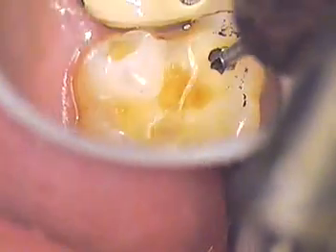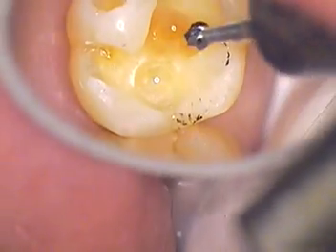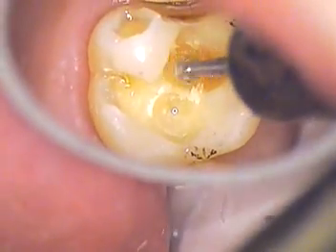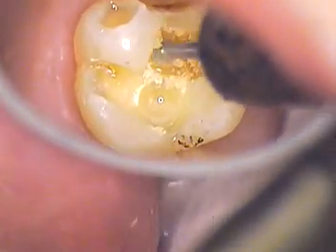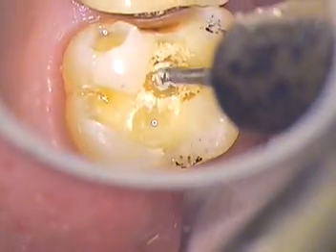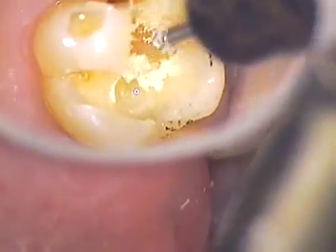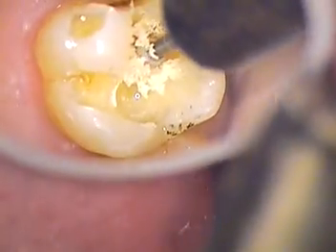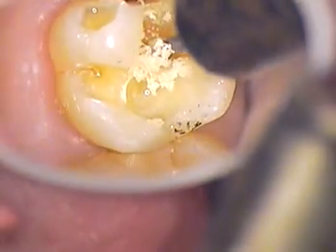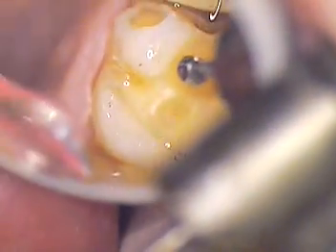As you can see on that mesial aspect, we've got a little bit more. Let me have another mirror, Maria, please. Let me just clean a little bit more and we'll change out our mirrors. You can see how the compromised dentin just flakes away very easily. Now we're using a stereo zoom microscope.